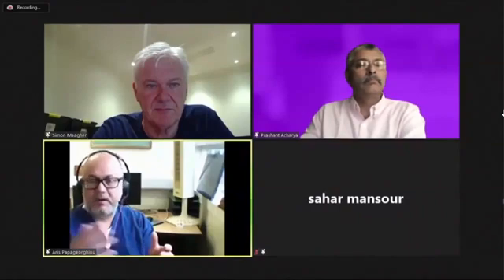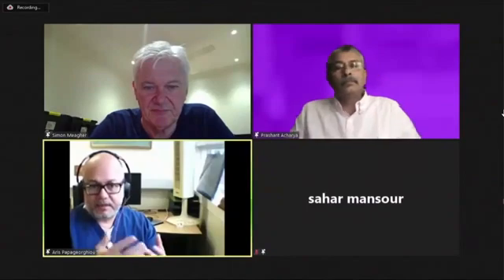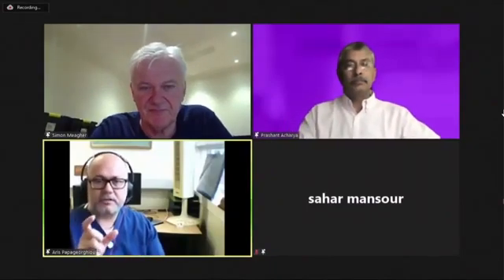So the classic way of thinking about IUGR is that the AC is the first biometric variable to fall below the 5th centile, followed by the femur, followed by the head circumference, because you have a degree of brain sparing. But actually what we showed in that study that I showed you during my talk is that in very severe early onset growth restriction, sometimes the first presentation is a short femur.